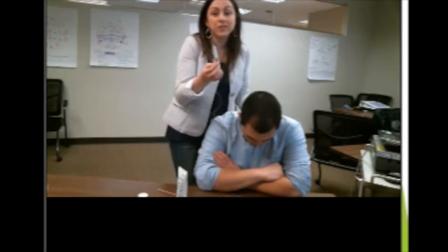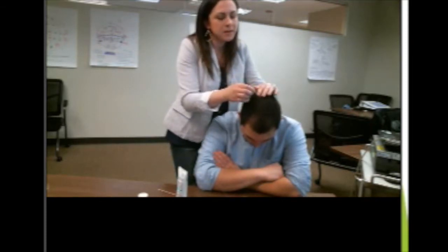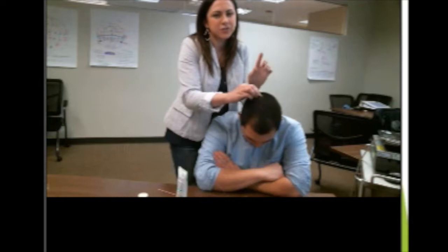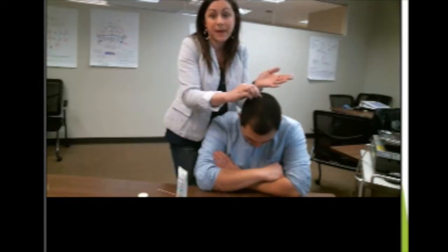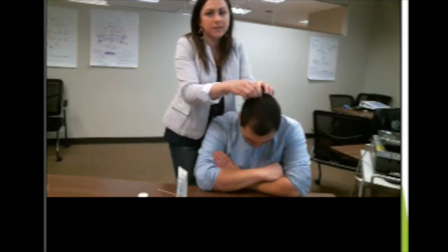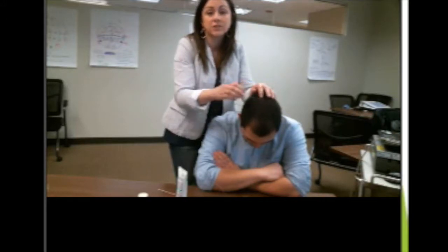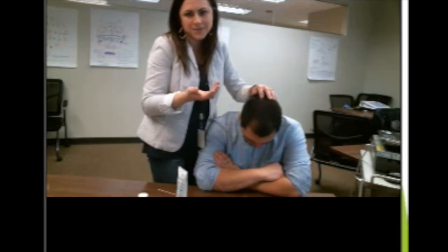And I'll apply the gold cup with paste to the patient's scalp, applying minimal pressure just until I see some of that paste protrude out of the hole in the center of the gold cup. And that tells me that the paste has filled the cup. The paste is sticky, but it's not glue and it won't harden, so it helps sometimes to place a small piece of gauze or tissue over that gold cup to keep it in place.